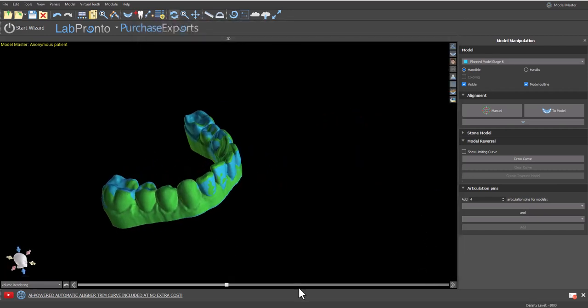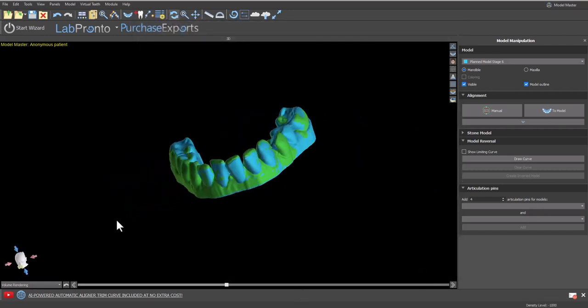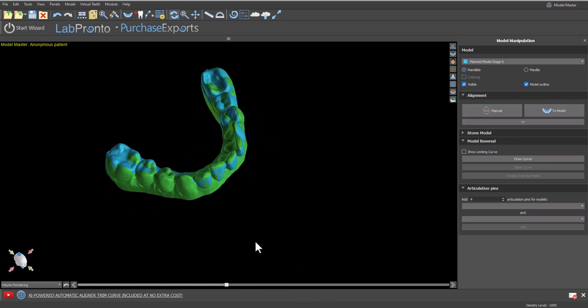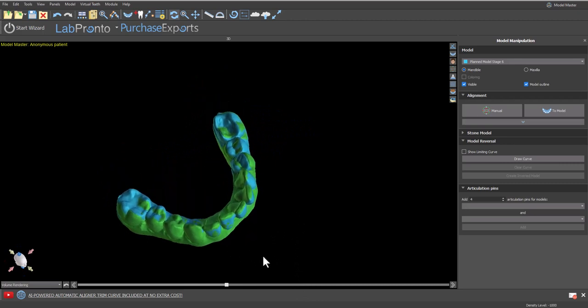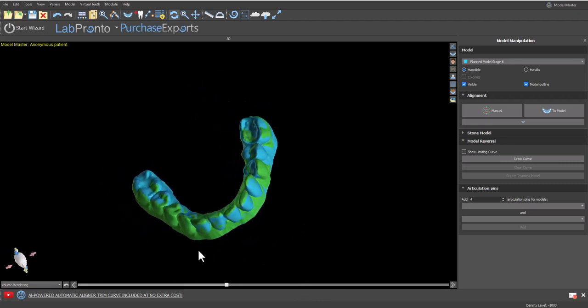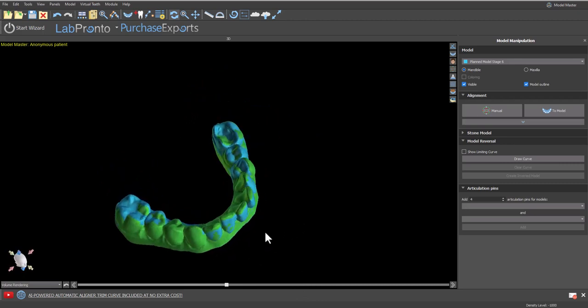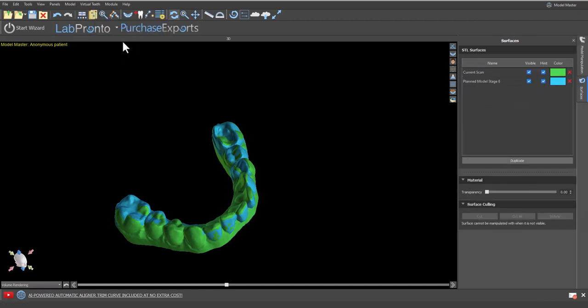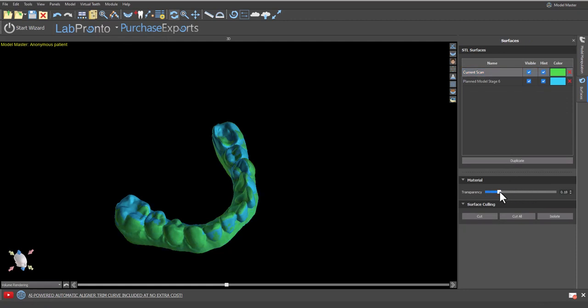And here we have the corresponding alignments between the two models. We can visualize any deviation between the digital model from the plan and the model of the actual patient teeth. We can improve the visualization of any deviation by going to the surfaces panel, selecting the relevant model, and using the slider to increase or decrease transparency.